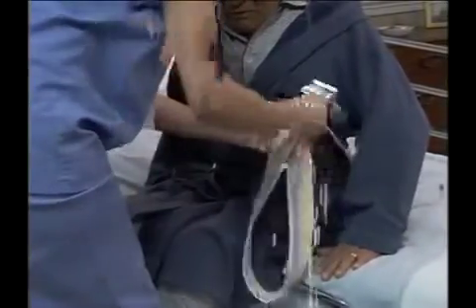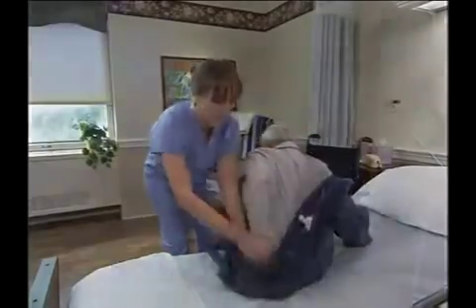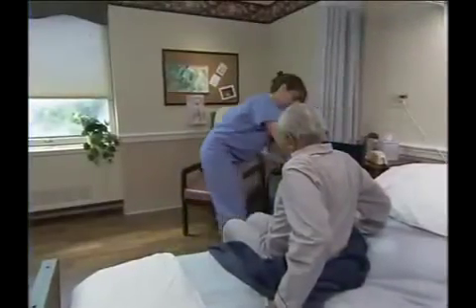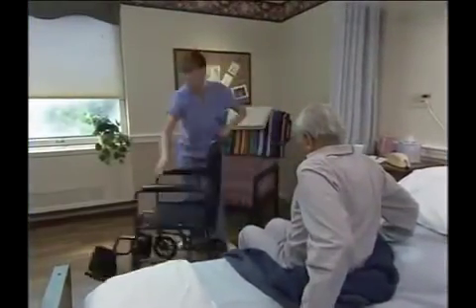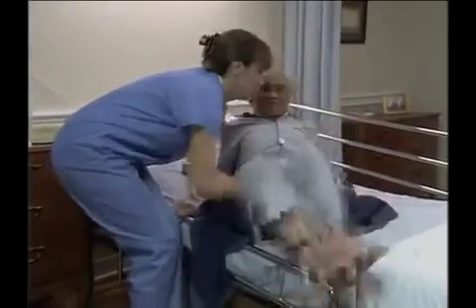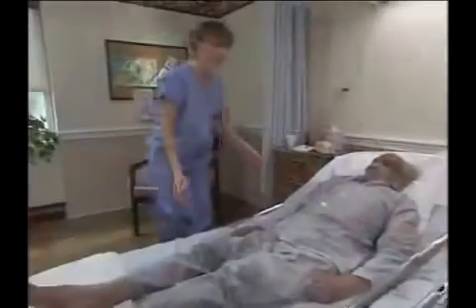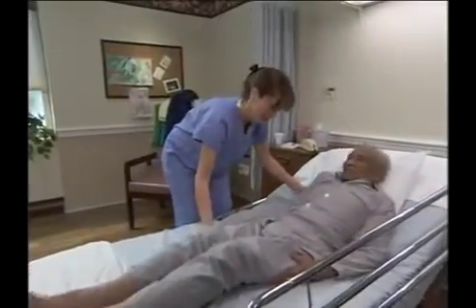Now, remove the transfer belt. Remove the person's robe if appropriate. Then his slippers. Next, move the wheelchair out of the way. Place one of your arms around the person's shoulders and one arm under his legs. Swing the person's legs onto the bed. Help the person to move to the center of the bed.